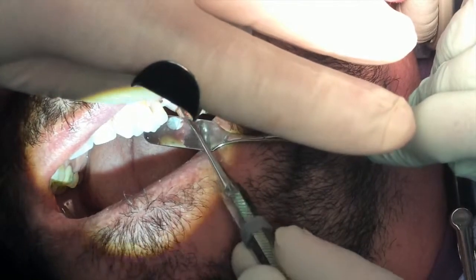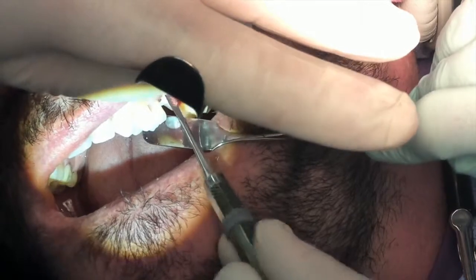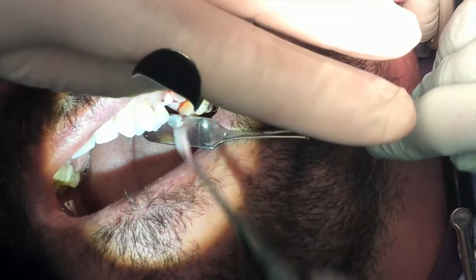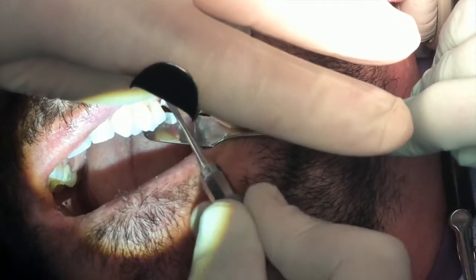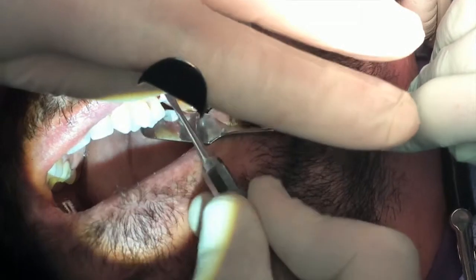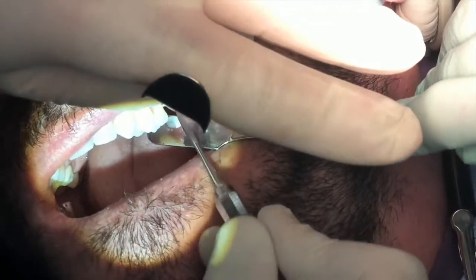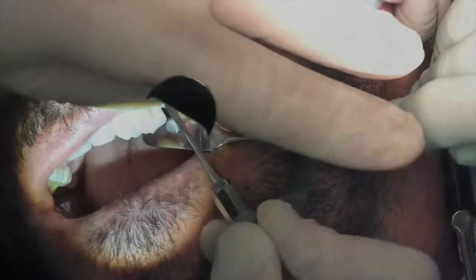And there's no membrane going to go in here. You put a membrane if you want. But in my paper I published in May, my 15-year, 5,000-site study, I categorized four different types of defects, how to address them, when to graft them, when not to graft them, when to use a membrane or not. I have a pretty good flow chart. But for me, from this standpoint, there's no reason to put a membrane in here. This is going to remodel into a little bit of bone and then connective tissue, which is what we want on the facial.